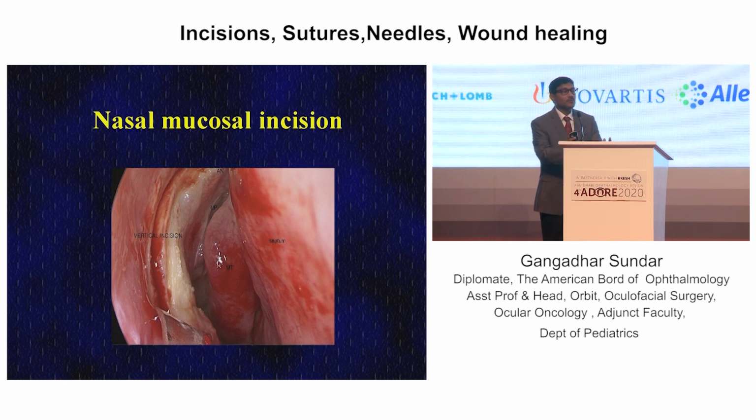So when you go to the mucosal incisions, in the past, we were creating an incision, chopping off your mucosa. Now, the more delicate you handle these incisions, the better the wound healing. Preserving the nasal mucosa and preserving the lacrimal mucosa and opposing them to each other, sometimes with glue, sometimes with nothing, and there are surgeons who even use sutures, actually aids healing by primary intention, which we'll talk about later on, rather than secondary intention, which was the way it used to be. And this is ideally created with a cold steel knife or a radio frequency device.